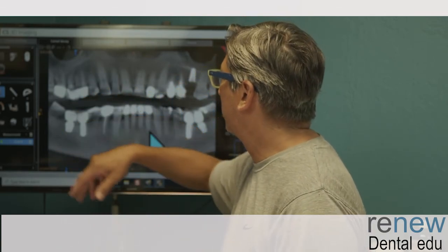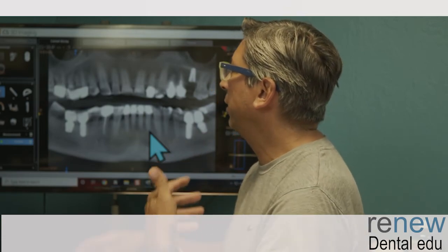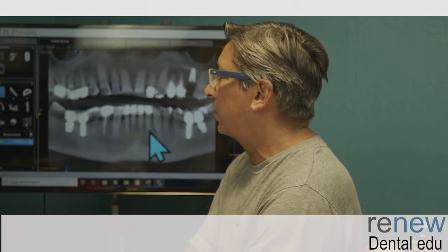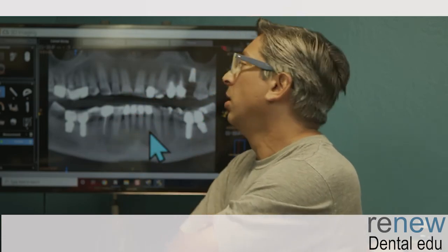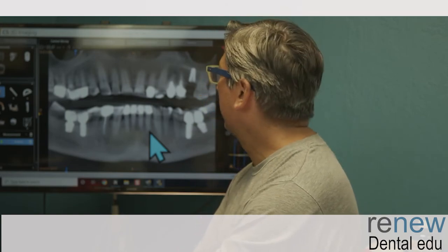He's got fillings here, root canal treated teeth here. Those are all going to fail. So that's all great for your practice. He's got wisdom teeth. He's probably going to have problems on his second molar, etc., etc. So he's got more and more dentistry in his life than he actually realizes. He will probably go his entire life doing fixing, maintenance, and a lot of care that he's going to have to be putting into his teeth.